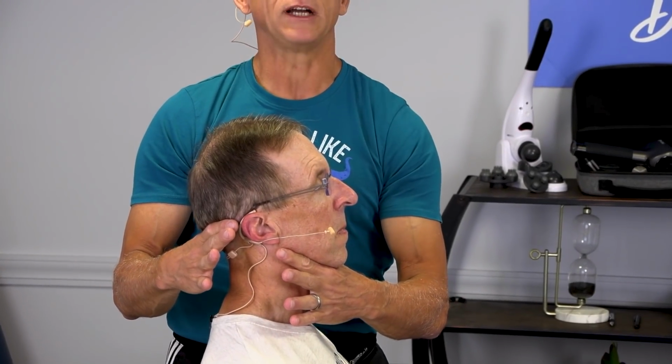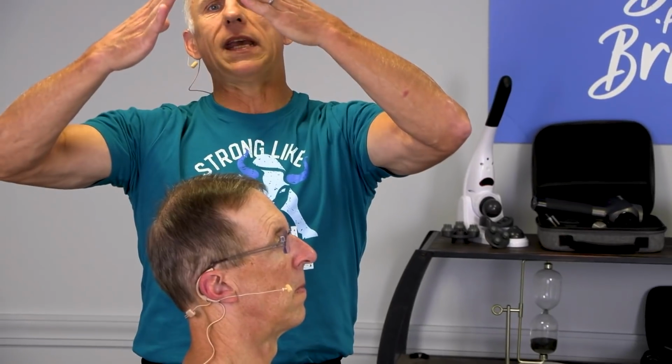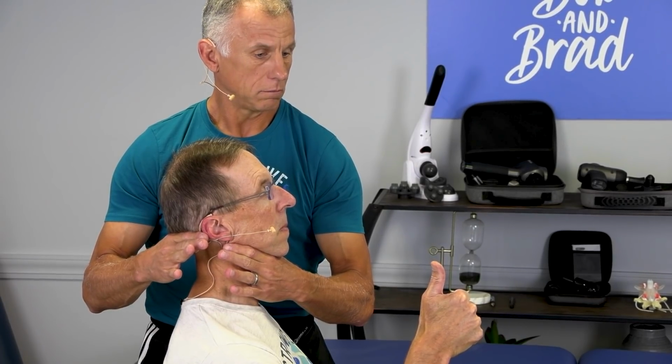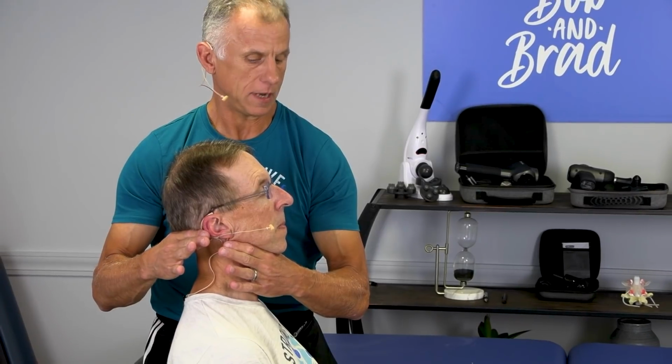Now, Bob's not going to be able to talk, so I'm going to say if it's painful or uncomfortable, just wave your hand, stop. If it feels good, give me the thumbs up. And I am not going to heave and hold. I'm going to gently go up, and Bob's going to let me know. If it feels good, keep your thumb up. Feels okay. Okay. So it feels good? Mm-hmm. Okay, yep, you can do it.